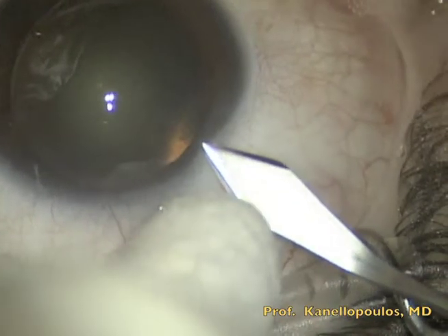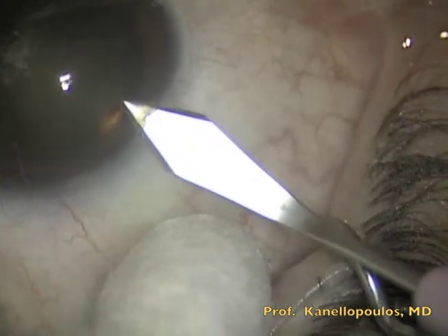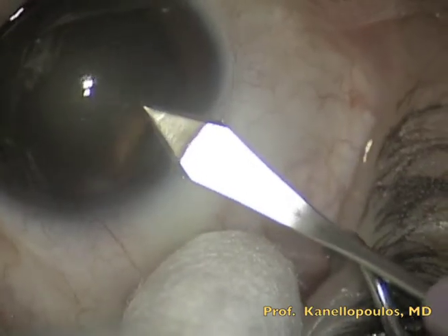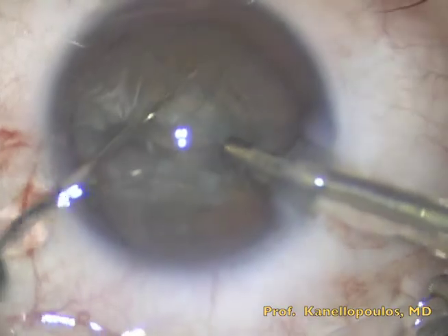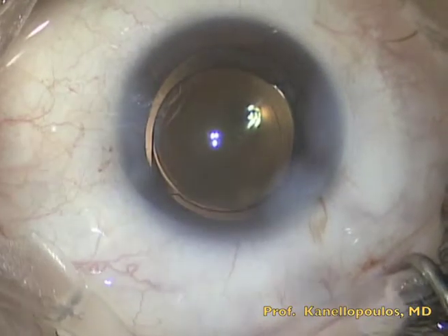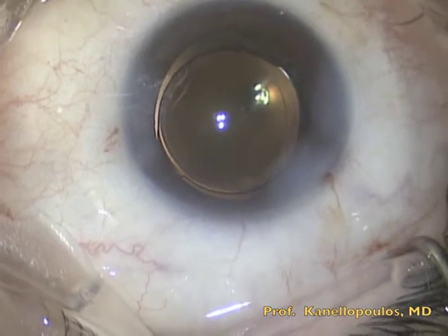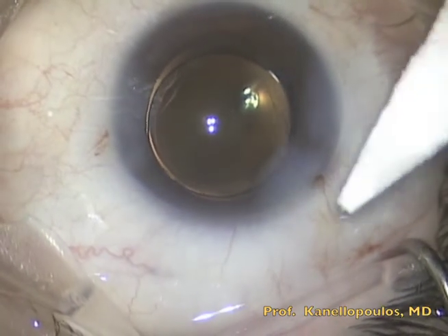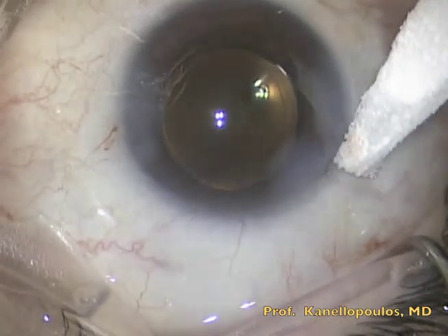Here is a clinical example from our center in Athens. This is a clear cornea case where careful care is taken for the incision to be beveled. Entry is made with a 2.75 keratome to assure that the incision is dry. The incision is dried in real time using a spear sponge.